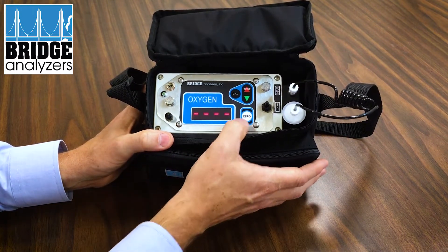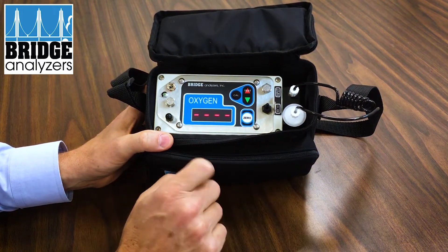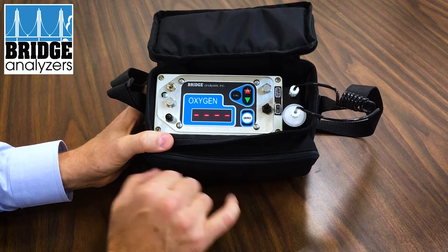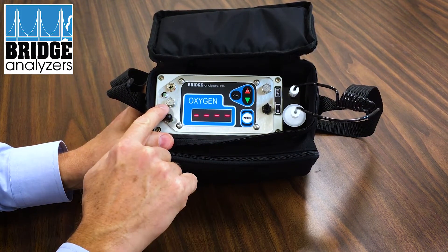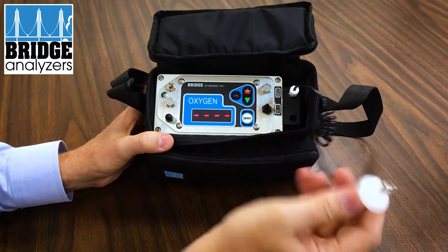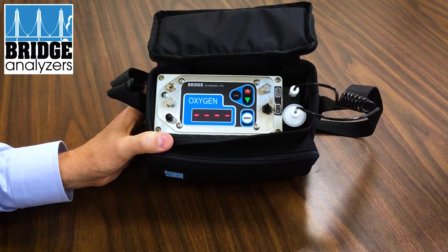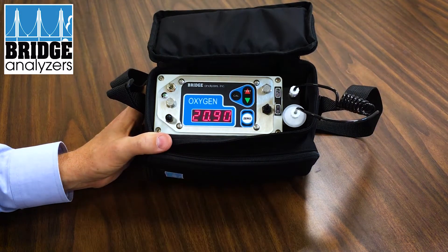To zero the analyzer, push down the zero button and hold it until the pump starts and the dashes start blinking. At this point the analyzer is drawing air in through this port here and exhausting out over here, so no air is being drawn in through the sample needle. The zeroing process sets the reference level for air — air is 20.9% oxygen, and you'll notice that's where we start.